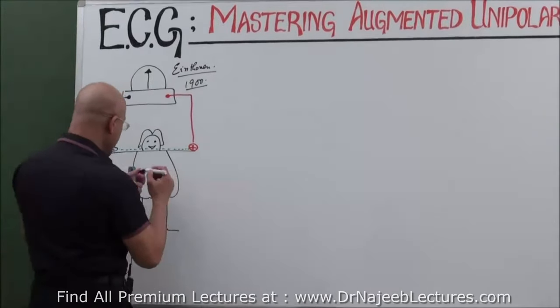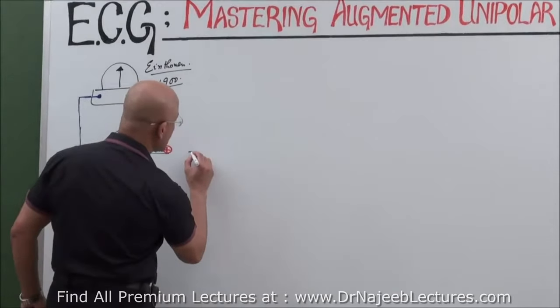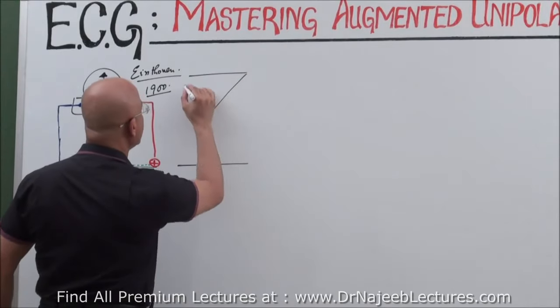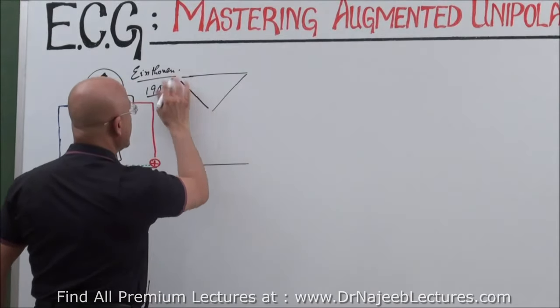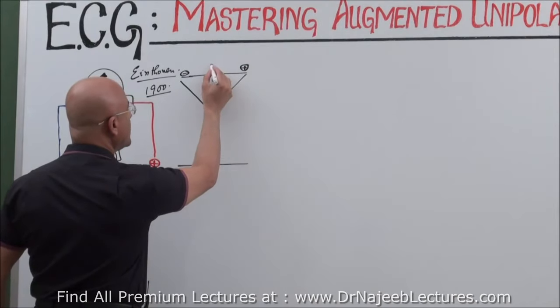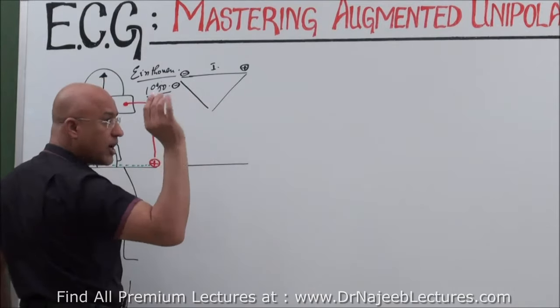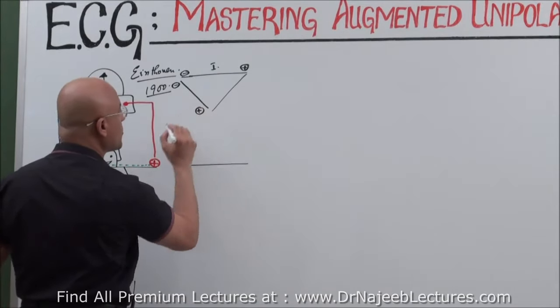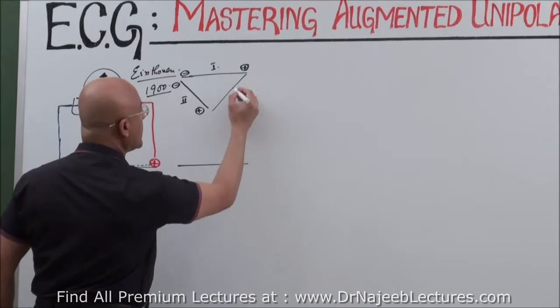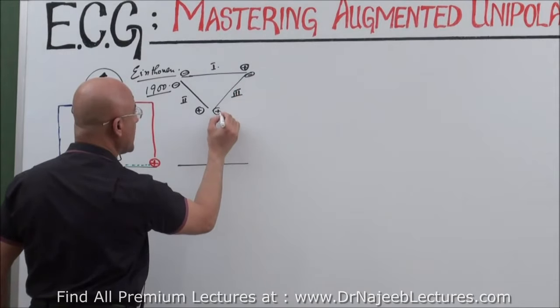And these limb leads can be shown like this. What is this? Einthoven's triangle. Negative terminal here, positive terminal here. What is it? Lead number one. Negative terminal here, right arm, and positive terminal here. What is it? Second lead, and this is the third lead, the third bipolar limb lead.